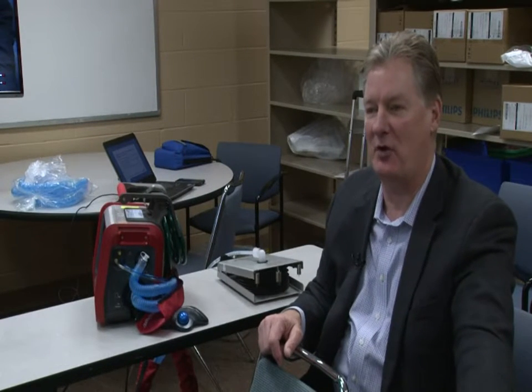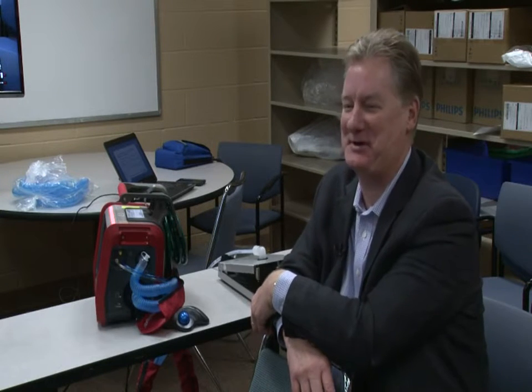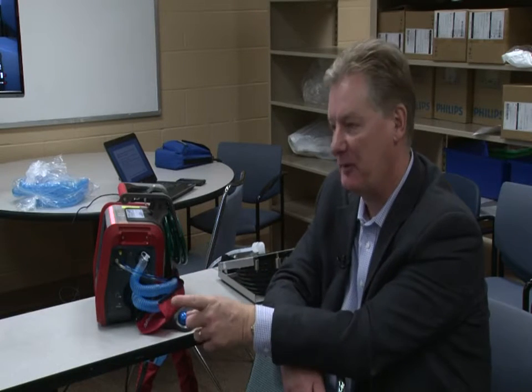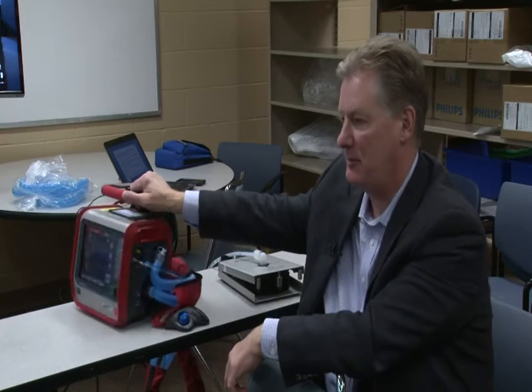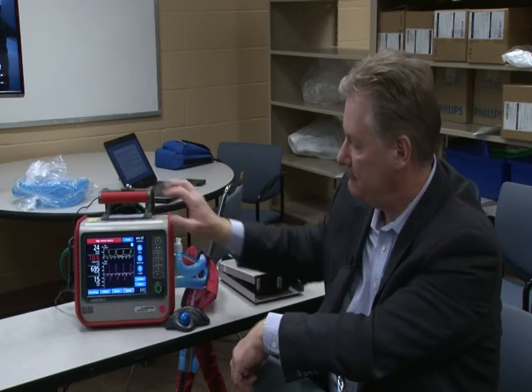So which way is the flow going to go? It's going to go past the flow sensor towards the circuit, and the ventilator is going to say, hey, the patient's still exhaling, I'll wait to give him the next breath. We had somebody put a patient on a one breath a minute kind of thing as a byproduct of that, so you don't want to do that. So the best place is between the circuit and the flow sensor. The best place would be there, yeah. Back one intersection, right there, yeah.